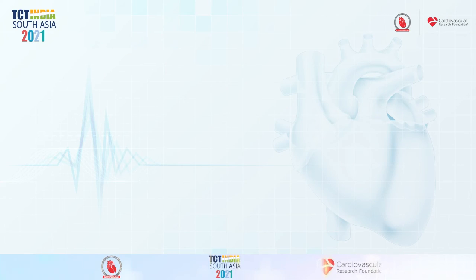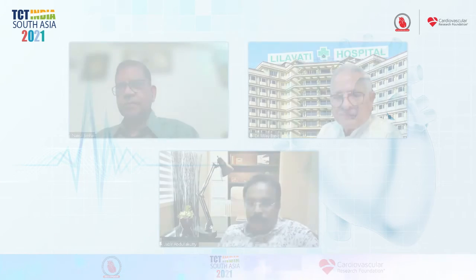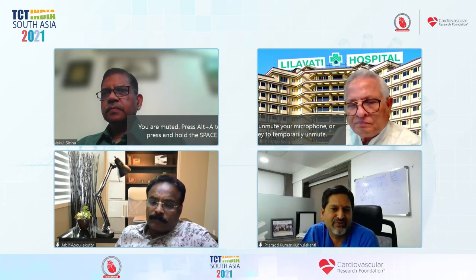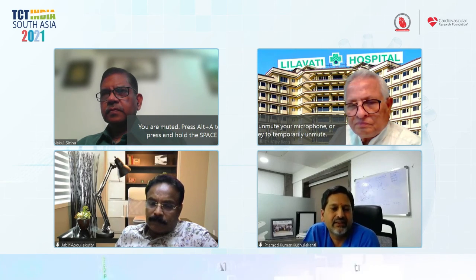Yes, I think it is a well-done case and demonstrates that in ACS with vein grafts, a thrombotic burden is possible. And sometimes what we can do is keep the patient on heparin infusion because it is not an emergency case here. It is called marinating the vein graft, and subsequently the burden will be less. Because as you know, the 2B3A inhibitors are not useful in vein graft interventions. And definitely they need to be commended for using the imaging, identifying the thrombus and covering it with the additional stent. The final result is very good, definitely.